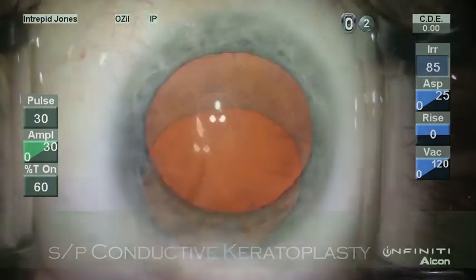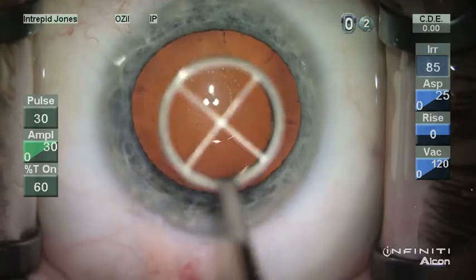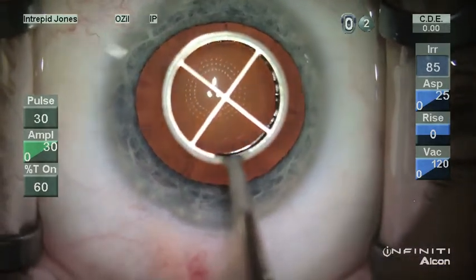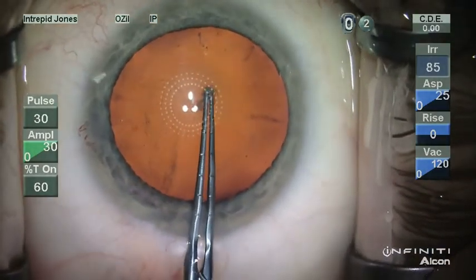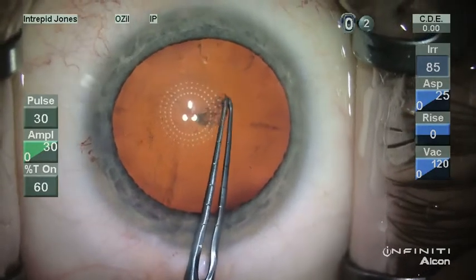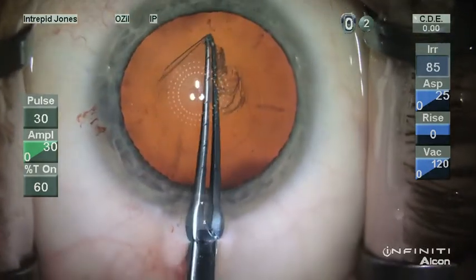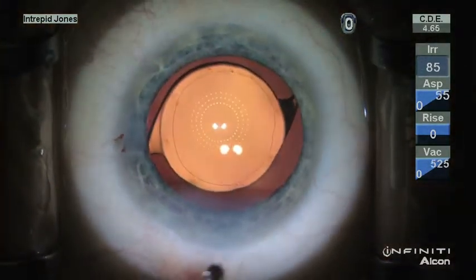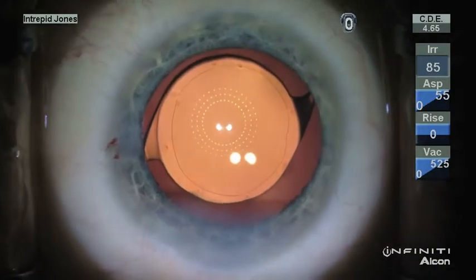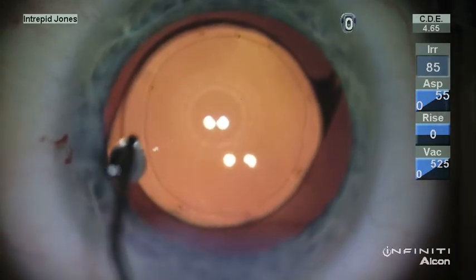This patient has had a previous conductive keratoplasty, and once again, the patient fixates, the corneal mark is applied, and the capsulotomy is created. Because of the discrete fixation elements from the beacon, patients are more readily able to maintain fixation during the capsulotomy maneuvers, which aids in a more controlled and centered location. Here you can see the concordance of the keratoscopic readings, as well as the CK scars and anterior capsulotomy.